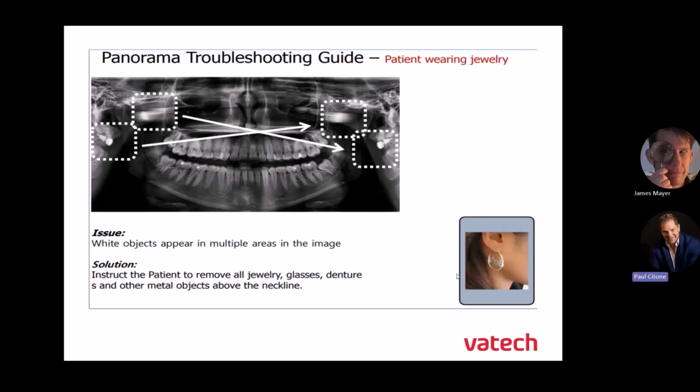So Jim, in this next image, we can see the patient clearly has earrings on, and that will not only show up in your image, it'll cause streaking. That's what we can see in the upper two white boxes on top there.